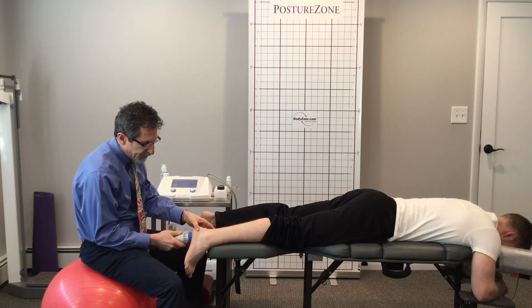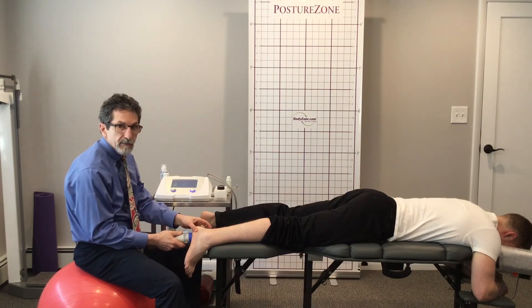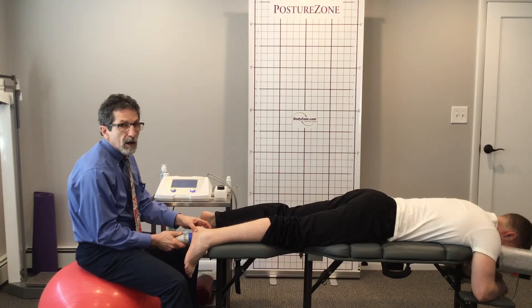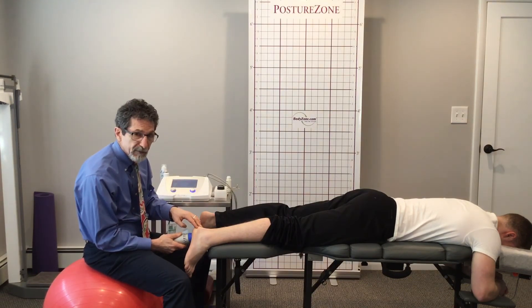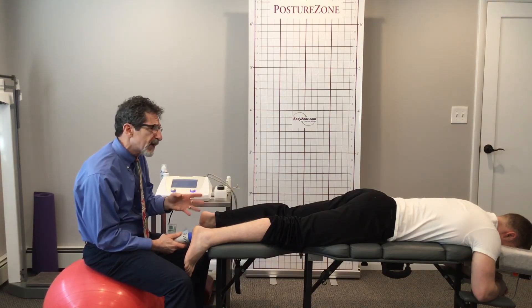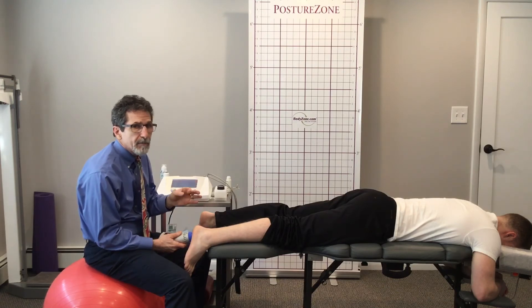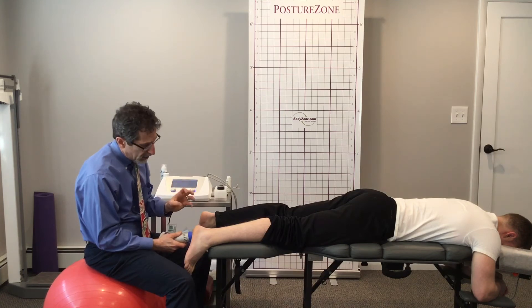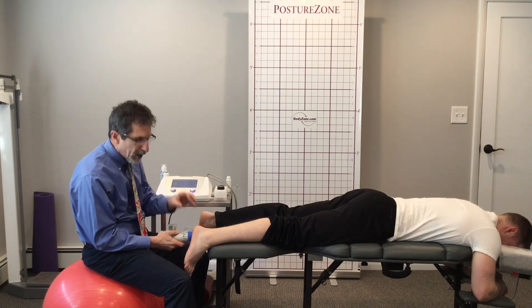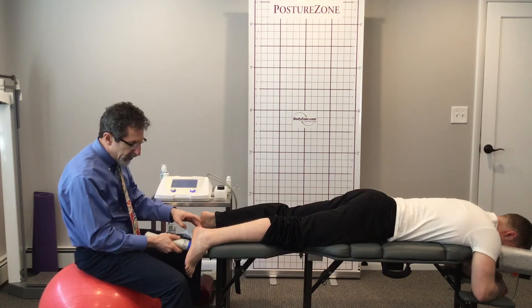The key is you want to get as many hits — literal hits on that area — as possible, that's tolerable. This will be a little painful; it should be about a six on the zero to ten scale. We want to do it for about a minimum of one thousand to three thousand hits. If we can get to two thousand, that's great. If it's too sore, since it's a radial wave, we move away from it a little bit and then go over to another area.